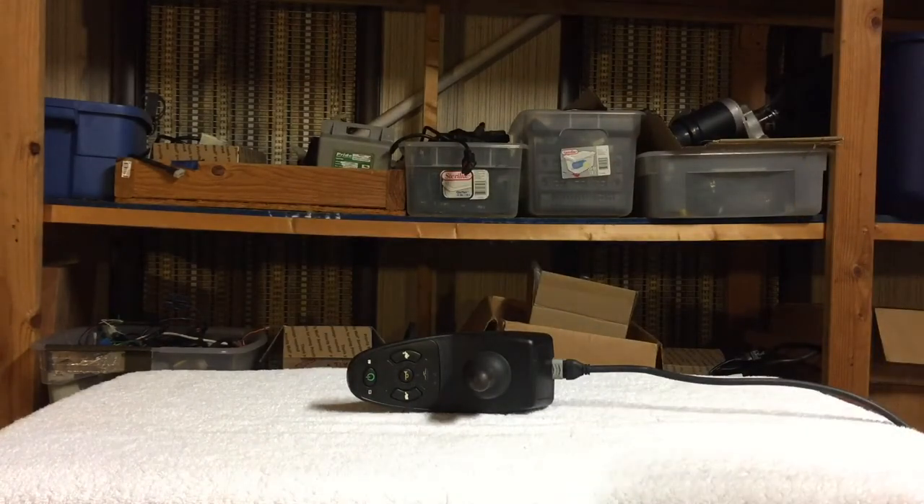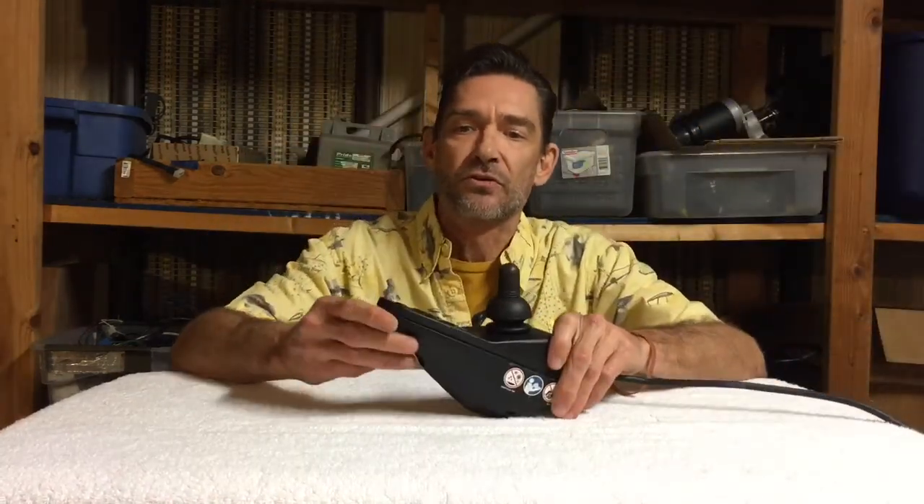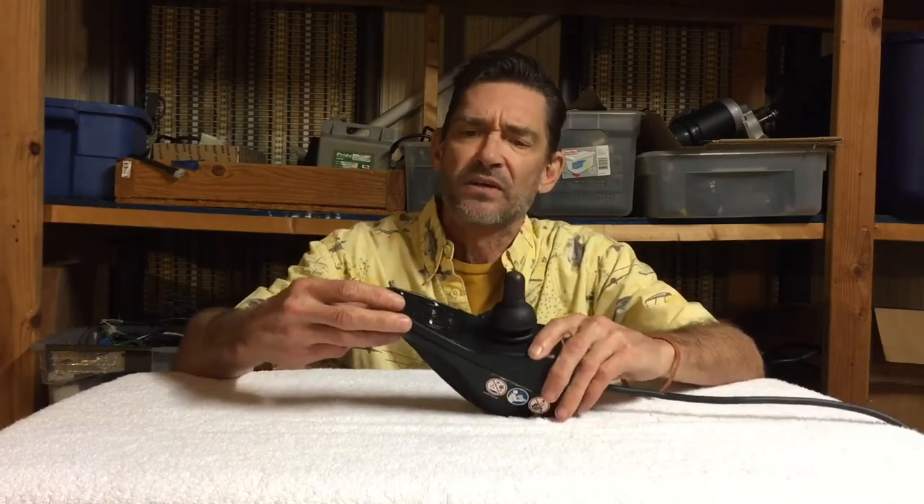That's just one thing - it's not that common, but common enough that you might be looking for it. Another thing would be a fault code. If you turn your joystick on and it's not doing anything but you get a little wrench down here that's flashing, what you do is count the number of times that wrench is flashing - that is your error code. Down below I'm going to have a link to the error codes for this particular joystick.